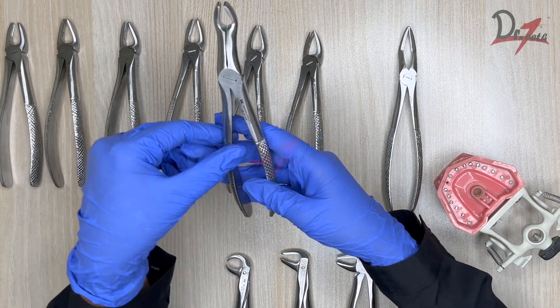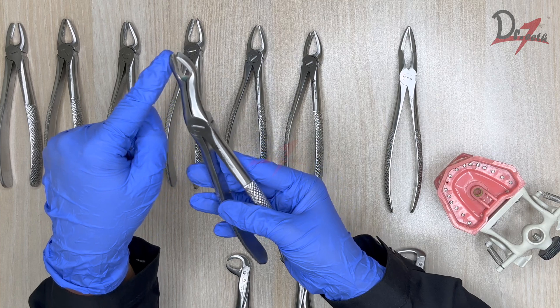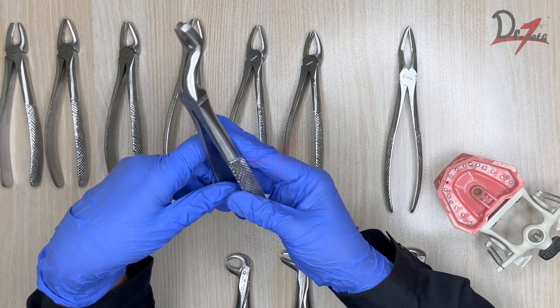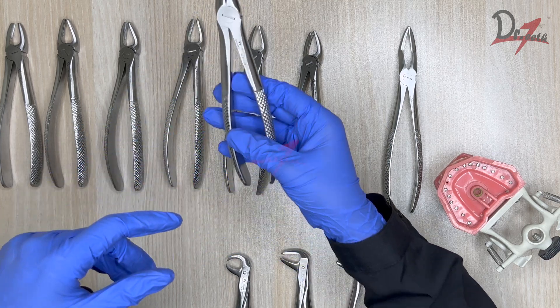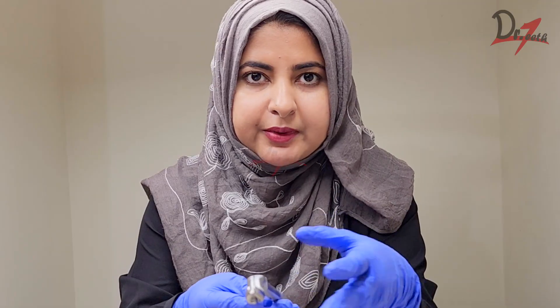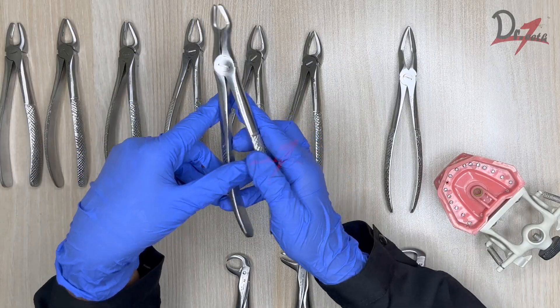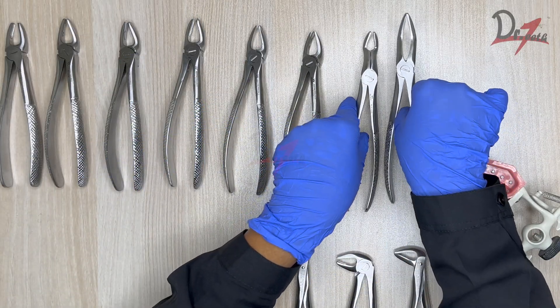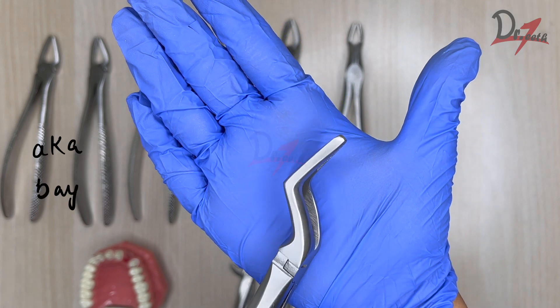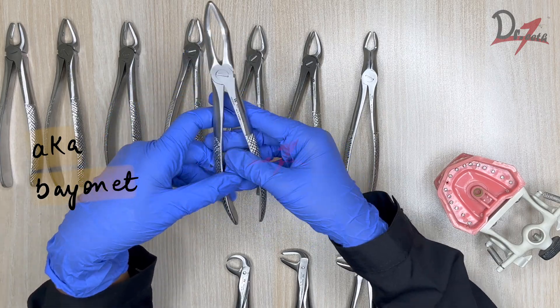This particular one is the third molar forcep — it has a very long beak, which helps in reaching the most posterior side of the arch where mouth opening may be limited. This is followed by the root forcep, which has a pointed beak with the beaks joined together. This design helps in the extraction of roots. These are the maxillary root forceps, and that covers all the upper forceps.